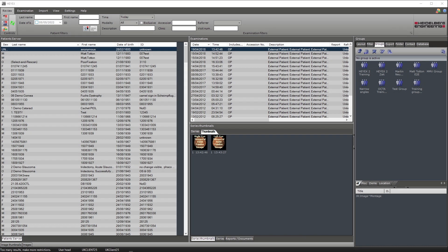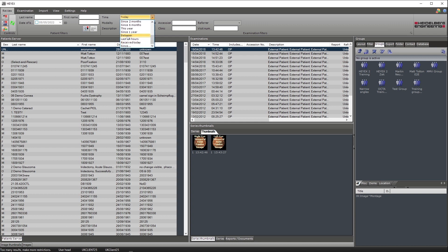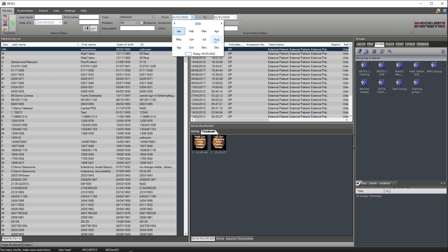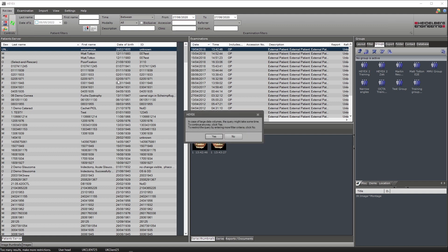To create a search through a time frame, select the time option on the ribbon bar. Click the drop down box and scroll down to the option between. When selected, it will allow you to create a custom time frame to search patients that have had examinations within the selected time.